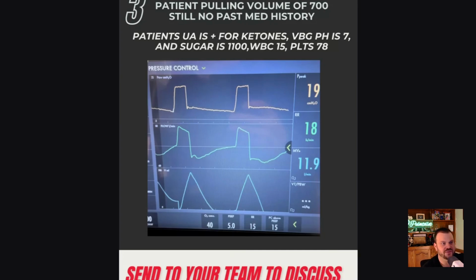If the patient doesn't get 15, but has maybe a few more breaths in a different time period, but a few less breaths in another time period, then the vent's triggering sort of intermittently because it's trying to achieve that 15 breaths per minute goal. Nevertheless, I do switch them into pressure support sometimes to see if it looks tremendously better. I don't find that it looks that much better all the time versus pressure control, especially if you have settings that are sort of appropriate.